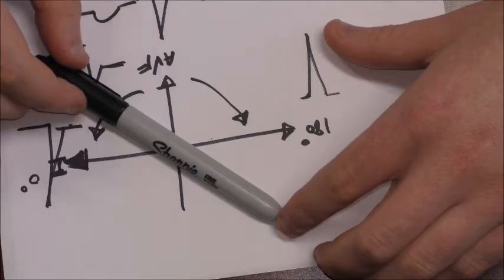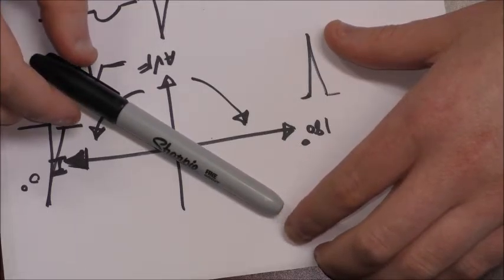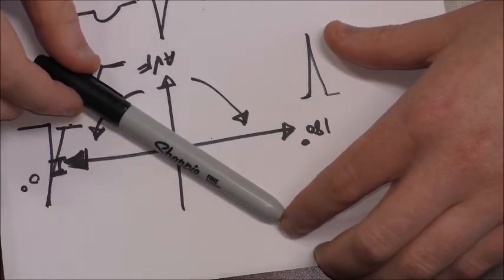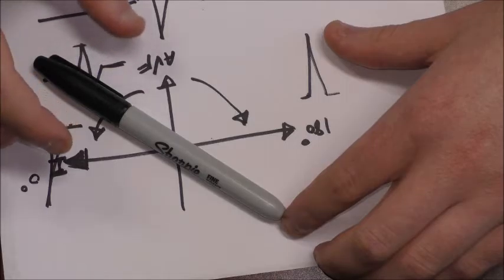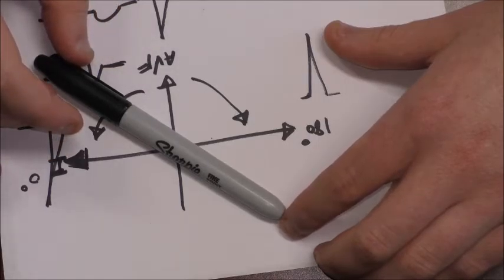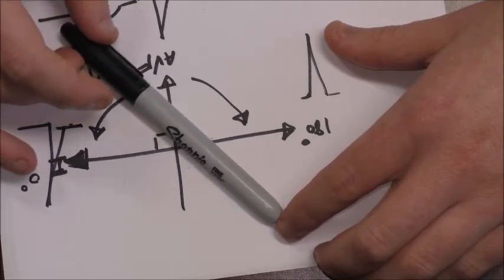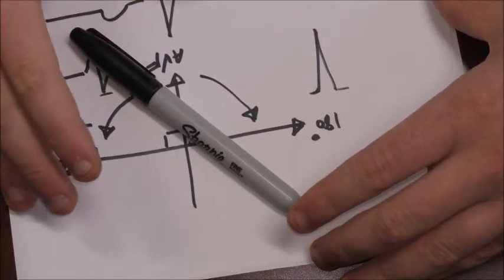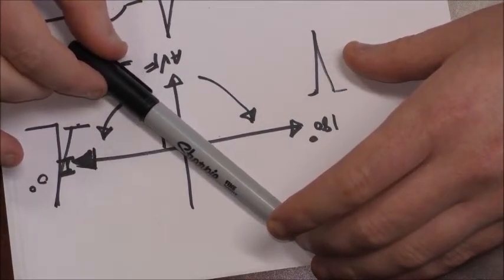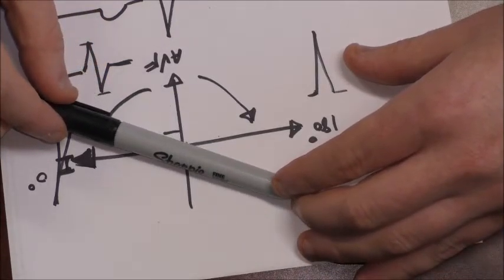such as left ventricular hypertrophy, and it makes sense because if you have a larger heart muscle, especially on the left side, due to long-standing hypertension or other issues, it's going to cause a massive heart muscle, a massive LV, and it's going to generate more voltage. So again, because this is a mean of the vectors, increased voltage coming from the LV is going to pull my axis more towards that side.